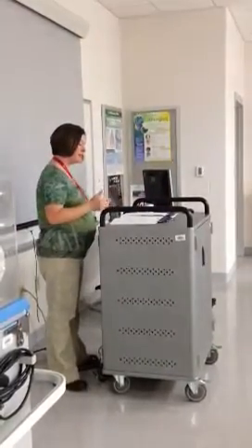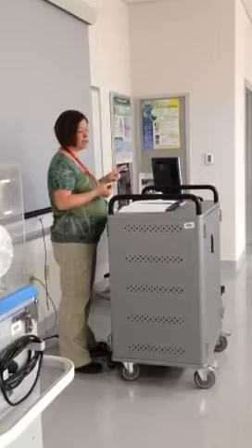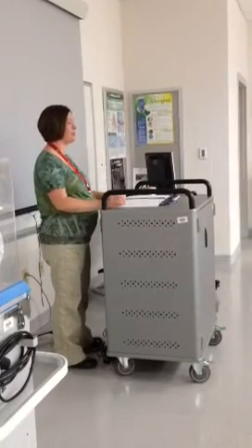A specimen containing visible air bubbles. If you have air bubbles in it, you need to get those out because one, it could tear up your machine, and two, it'll alter your patient's blood gas results. Okay? And then you'll have to go back and stick them again, so we don't want to do that.